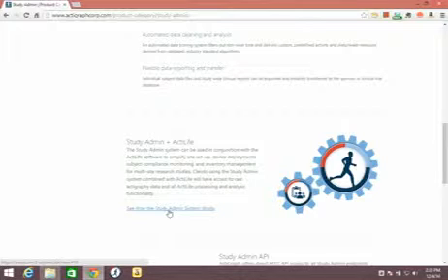It's a great little overview that may enlighten you on some ways that you can use this system to save a lot of money. And I think that one of our objectives is to produce a value add for you, our customers, that provides enough value to get you to use this system and save money and have us provide a viable product as well.